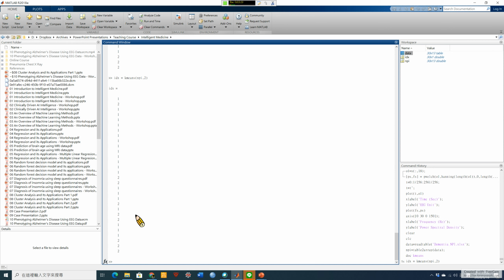If your data is very clean, which is not possible in clinical data, but ideally, then you should have a stable classification. But this is often not the case in clinical data. So that's why we need to be very careful about the results and the interpretations.